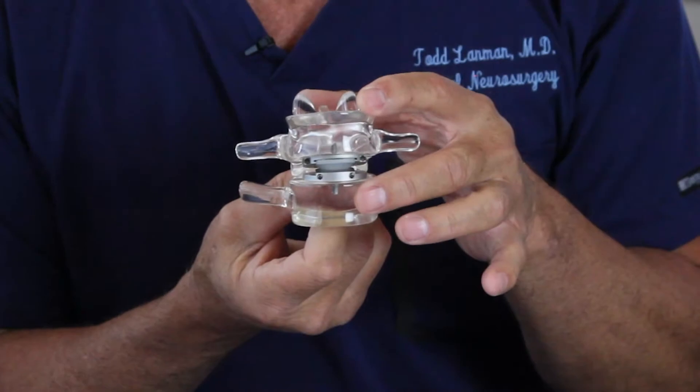Many people ask me how do these artificial discs work and how do you implant them? First of all, artificial discs are large and they replace the entire disc. This is a model of a low back disc replacement.